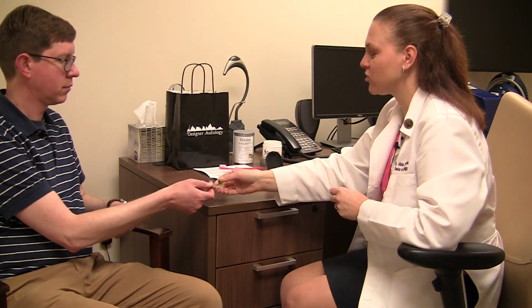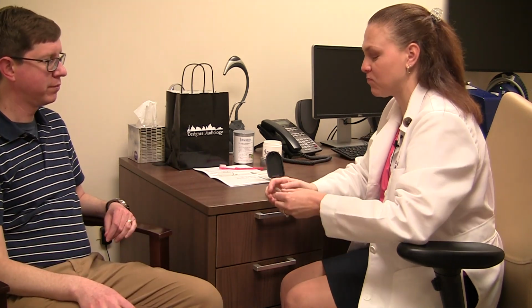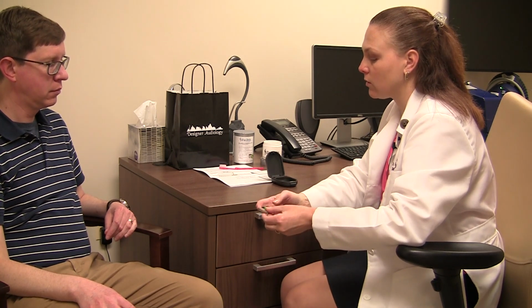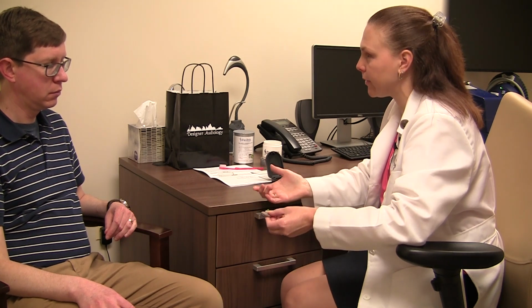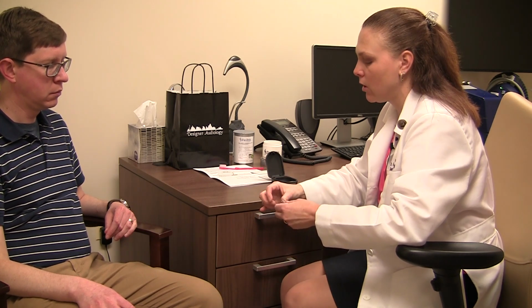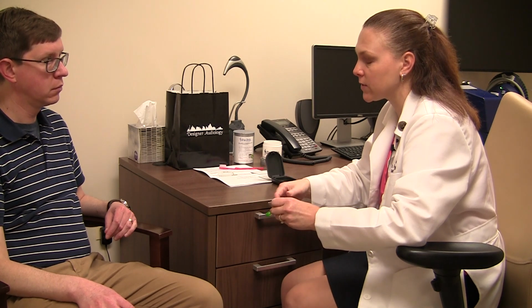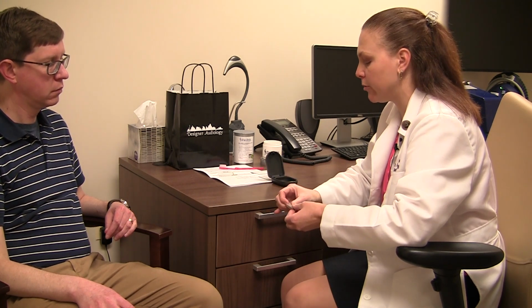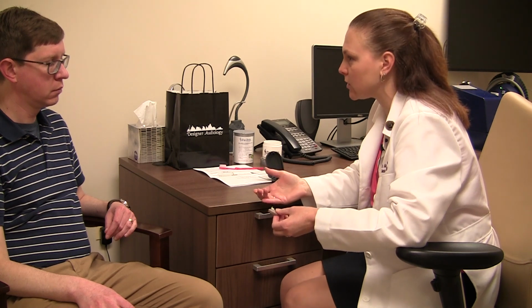Perfect. Questions on your battery? No. Okay. So like I just mentioned, if you open the battery door, there's a little catch and that will turn the hearing aid off. Or you can open it the entire way and that will also turn it off. But when you're not using the hearing aid, we want to save as much battery life as possible. So if you crack the door open, it will turn the hearing aids off and it'll save your battery. If you want to open it the entire way, that's perfectly fine too.